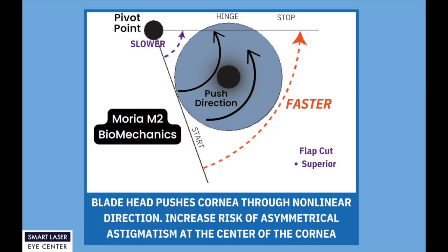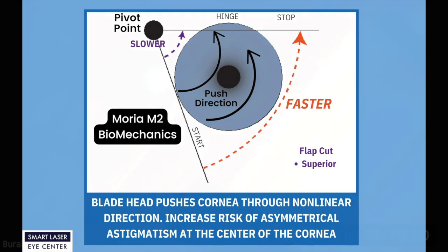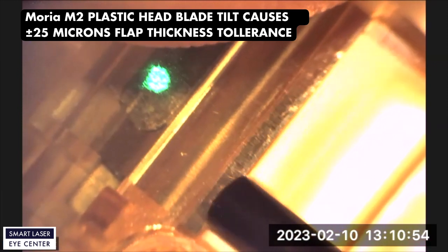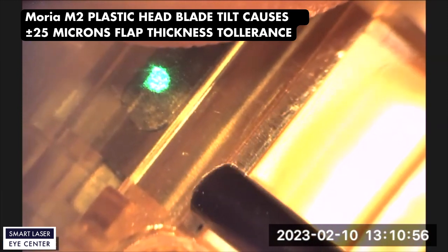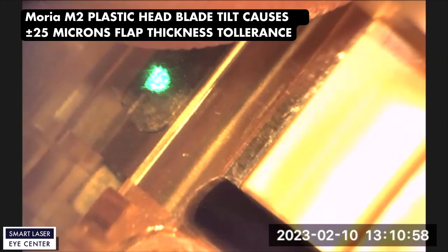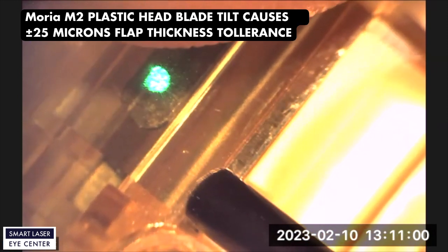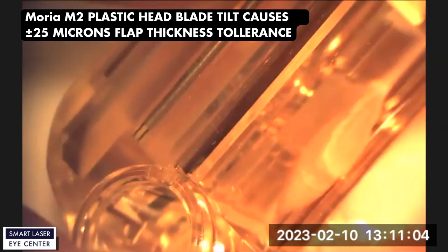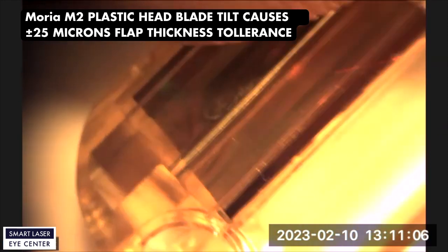Now let's examine Moria M2 biomechanics arc principles. The blade head pushes the cornea through a nonlinear direction, increasing the risk of asymmetrical astigmatism at the center of the cornea. If you examine the Moria M2 plastic blade head M2 SU-90, you can easily see how the blade tilts up and down. Therefore, the M2 SU-90 blade cutting flap thickness tolerance is approximately plus and minus 25 microns.